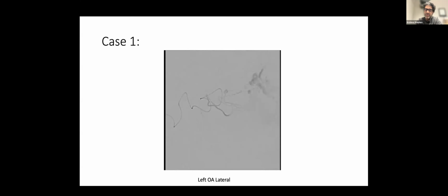I don't know. From an endovascular standpoint, as you mentioned before, and I can show you on the next case, when we do dyna CTs and you see the level of the fistula itself, if you don't get down to the single hole where the arteries converge to this venous head or the true venous outflow, it is never cured. So in my opinion, the clip was too proximal. It didn't get down to the level of the fistula itself. Yes, I agree on that.